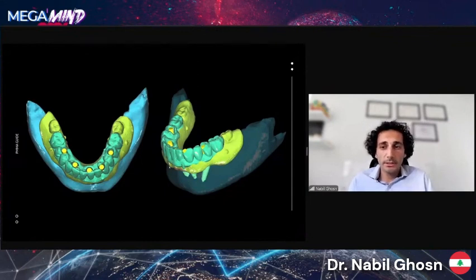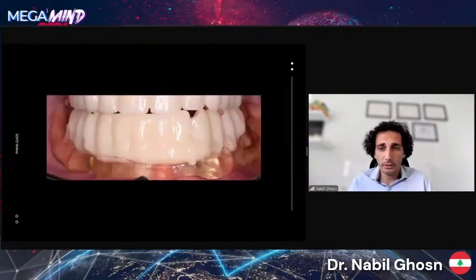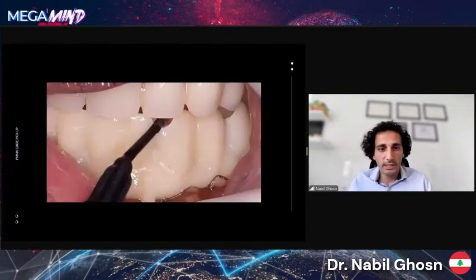We also designed an immediate fixed prosthesis for the implants, which comes with its own guide to position it correctly in the mouth with the desired position and vertical dimension. This is a copy of the previous denture design, but it's separated into 2 pieces, the PMMA part and the holder part. The PMMA and its holder are placed on top of the mucosa and the temporary cylinders placed inside the holes and relined using composite resin.